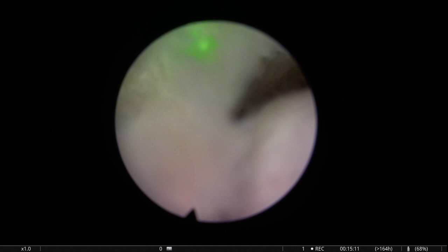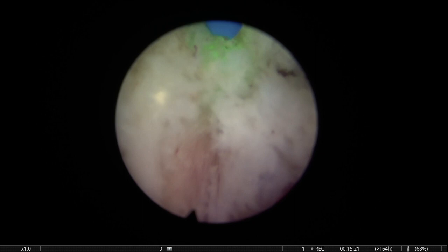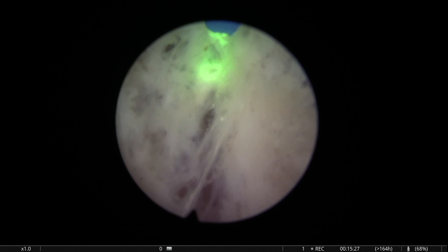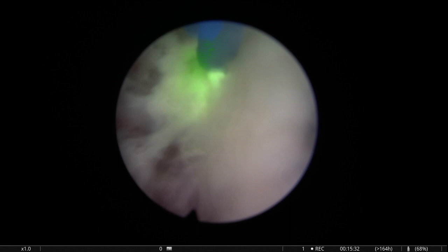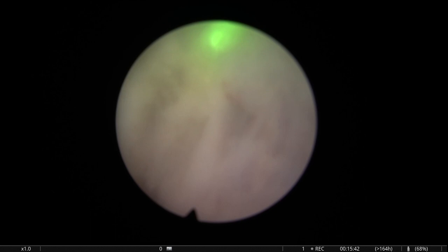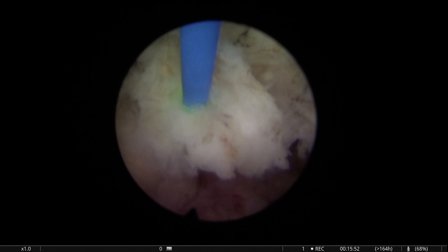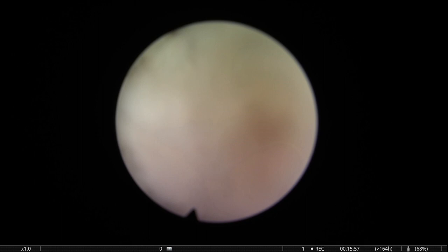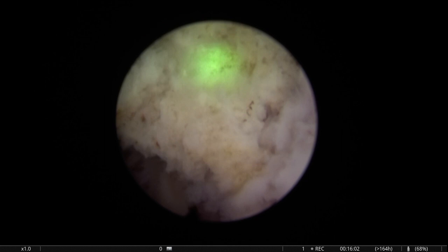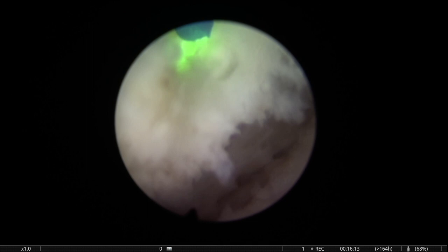So here you can see that also we have a slightly difficult plane. We are, you know, trying to get there, but this was not a forgiving case, it was not a straightforward case. Of course, you could probably follow the internal plane and leave some adenomatous tissue. You are removing a big adenomatous chunk anyway. But I think if you probe, if you look around, when you suspect that there's adenomatous tissue, if you go for it, you will develop the skills to move in deeper planes, let's say, with more confidence. And I think sometimes you can find a remarkable amount of tissue that otherwise would remain there. And in my experience, it's quite safe if you can move around and be careful and recognize the details.